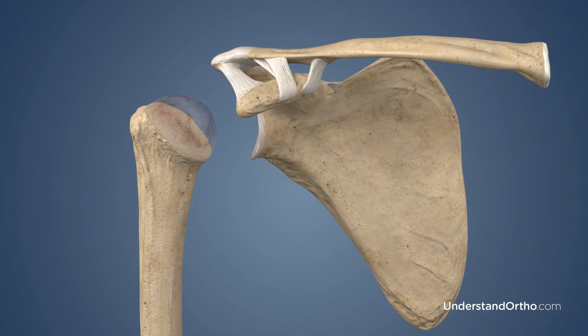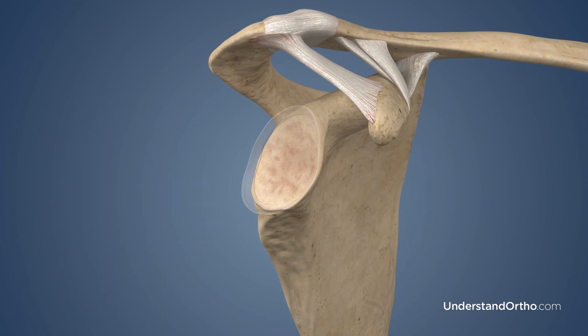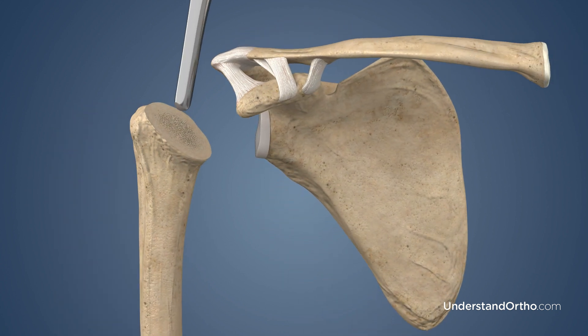Next, the head of the humerus is removed. The glenoid surface is cleaned and prepared for the implant, which is secured to the bone. Your surgeon then will create a space in the humerus and insert the humeral stem implant into the bone.